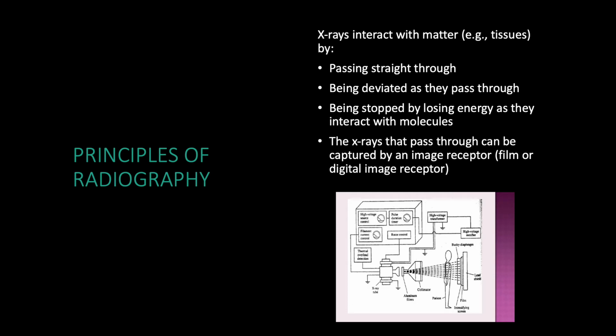Okay, so let's dive deeper into radiography in particular. As we look at how an X-ray is generated here, we look at the X-ray tube that sends an X-ray beam out. It interacts with the body and then is displayed on a film here. The film absorbs these rays based on the density of objects that it passes through and creates a film.